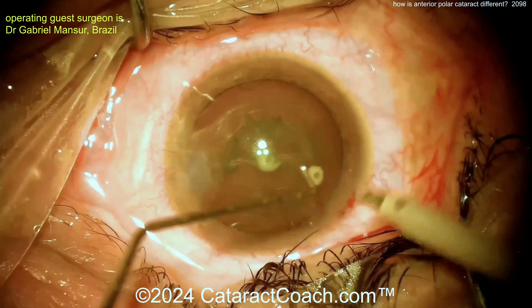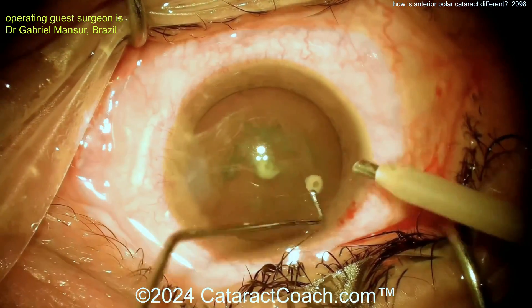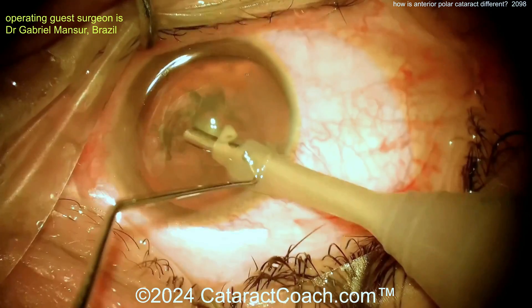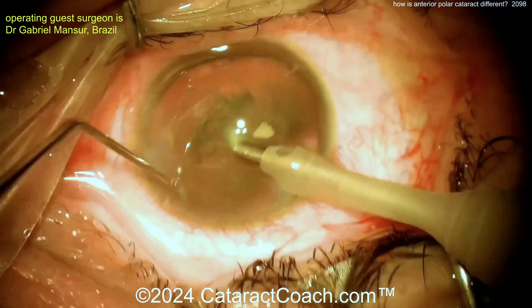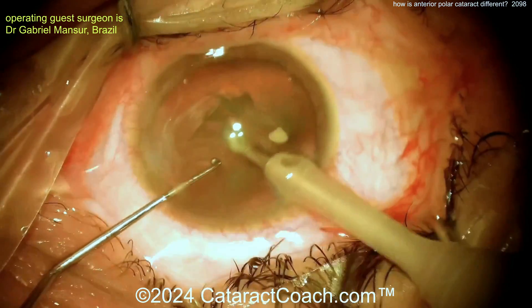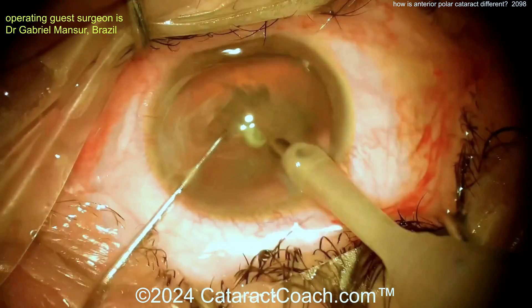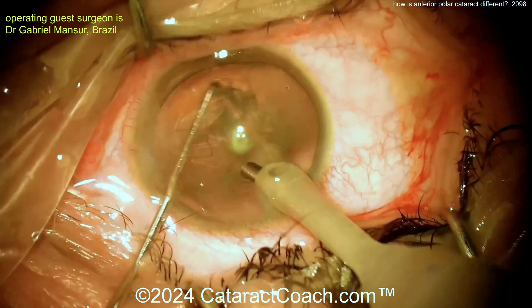So if you have a posterior polar opacity, be very cautious — watch the videos, do it differently. But an anterior polar opacity is really just a routine cataract case. Nothing out of the ordinary once you get that rhexis done.